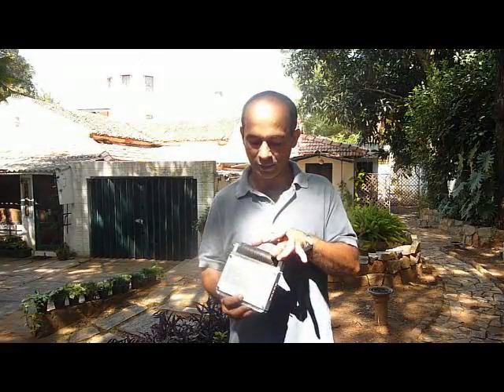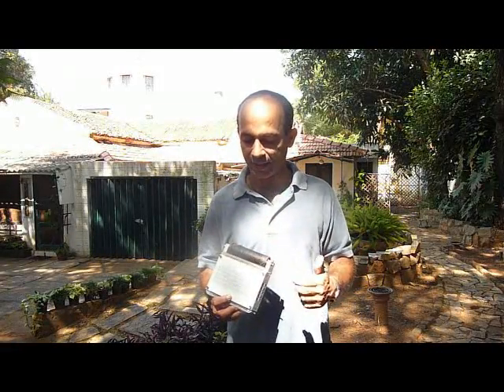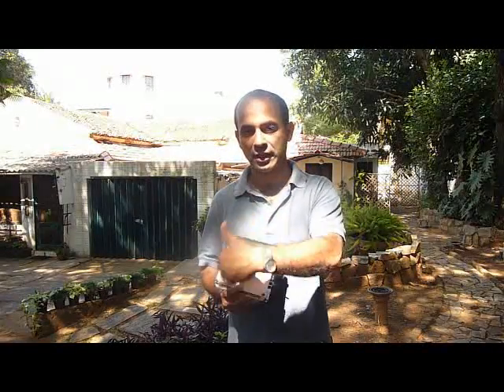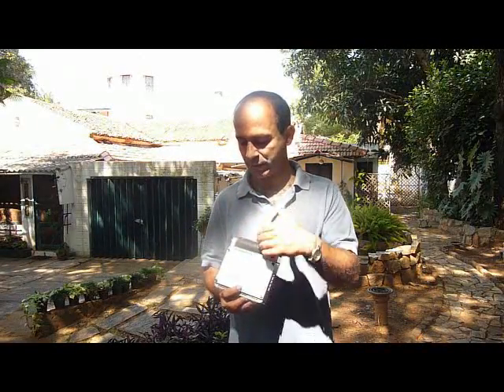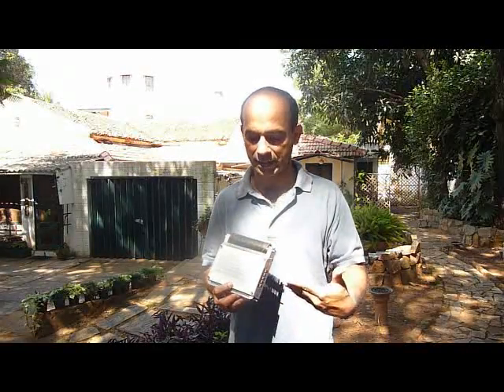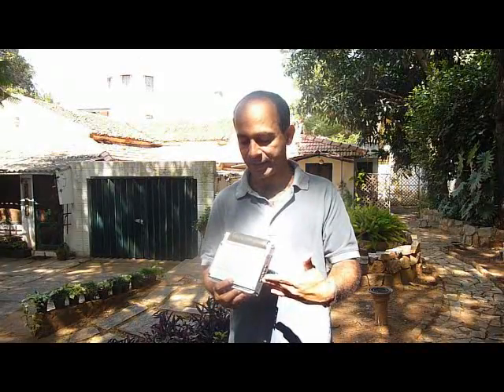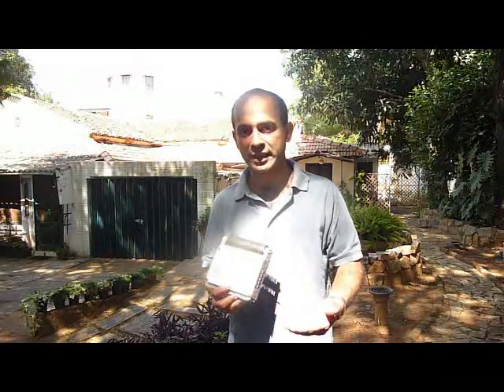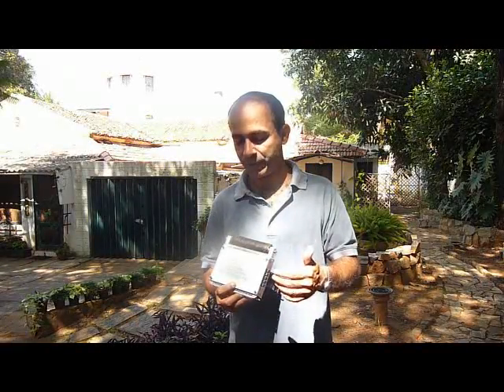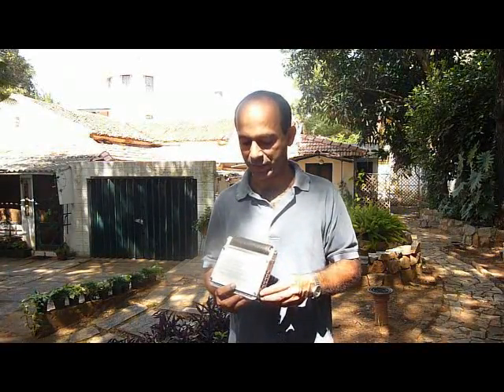This bank of cams, I'm going to take away half of it so that you can actually get a view from a different angle, and you'll be able to see how each pin is controlled by the column locking slides, which are controlled by the cam. You'll also be able to see the row actuators that move under every line of pins, and there are three actuators under every line. You'll be able to see exactly how they toggle a pin and not toggle a pin if the pins are locked in position.